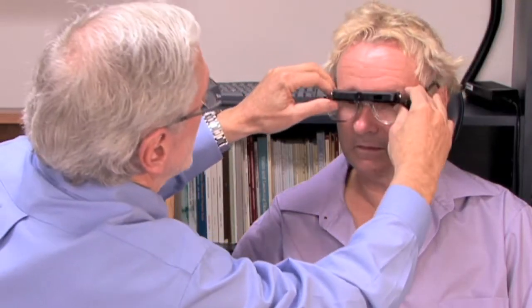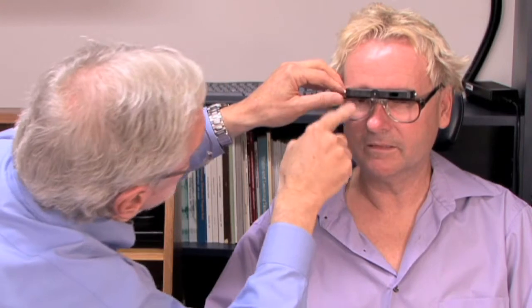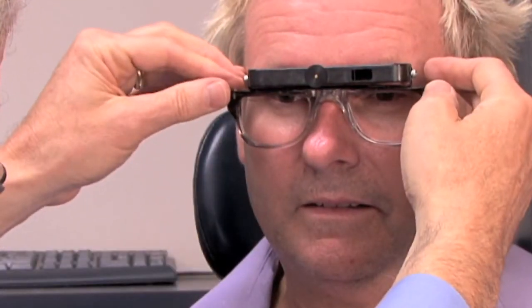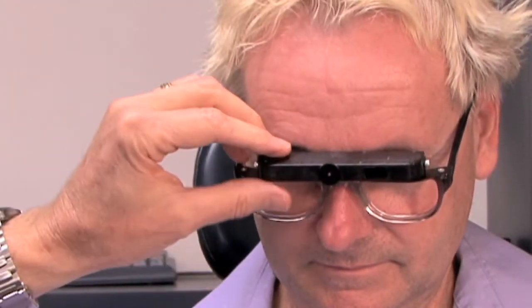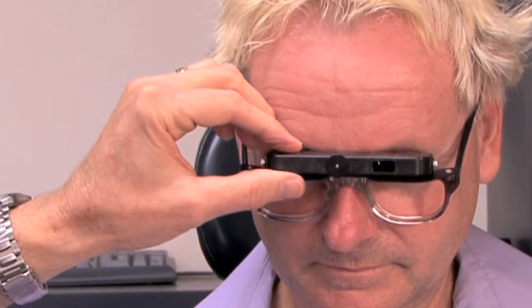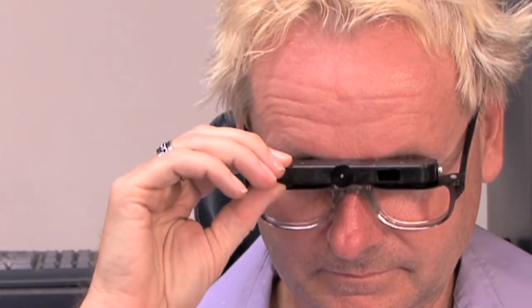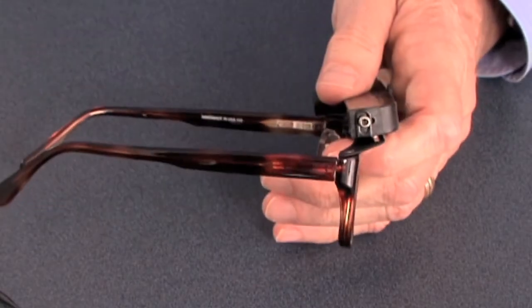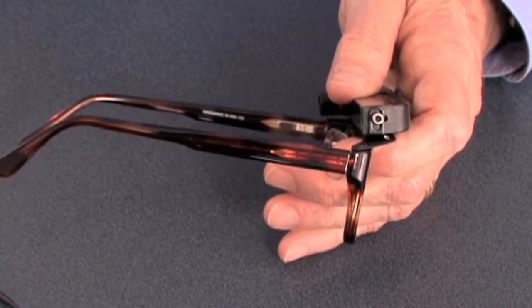Step two: we'll adjust the bridge so the telescope is as low as we can get it. The top of the frame is pretty close to the top of the pupil — and that's about right. Now we'll ask the patient to drop the head to look in the telescope and we'll change the angle of inclination so that he's looking directly through the telescope. Once we have the telescope lined up properly, we'll come in from the side and tighten that side screw so it doesn't move.